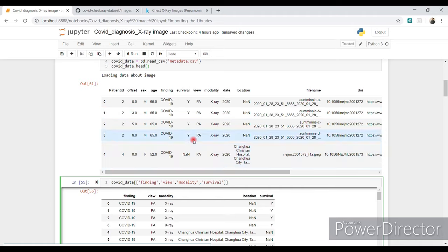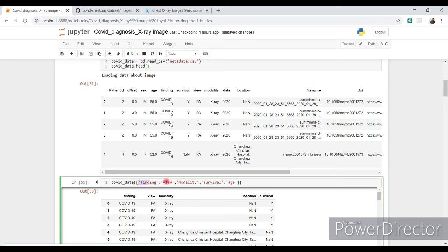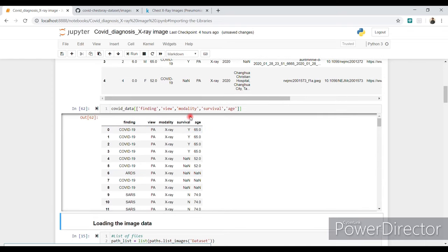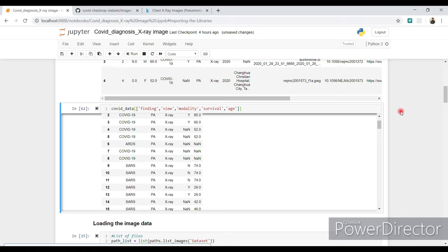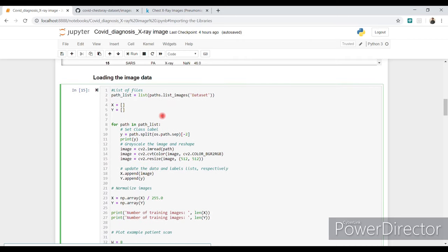I also keep the age column as it's relevant to COVID-19. This line prints the finding, view, modality, survival, and age columns of the COVID-19 data. Run this and you'll find those columns clearly. For example, patient ID zero has a COVID-19 finding, PA view X-ray modality, survival yes, and age 65. Now we move to loading the image dataset.